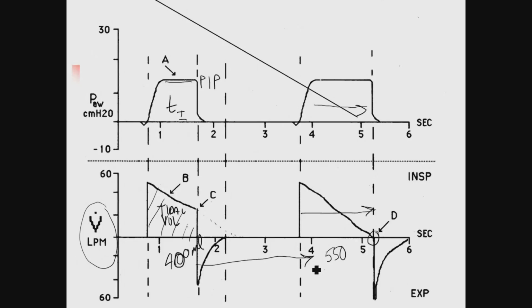Would you have to change frequency also when you do that? You wouldn't necessarily need to change frequency. You just need to be aware of the fact that as I'm lengthening I time, I'm shortening E time. And if the E time is inadequate, then I may need to look at doing something with frequency, because the potential for air trapping happens.